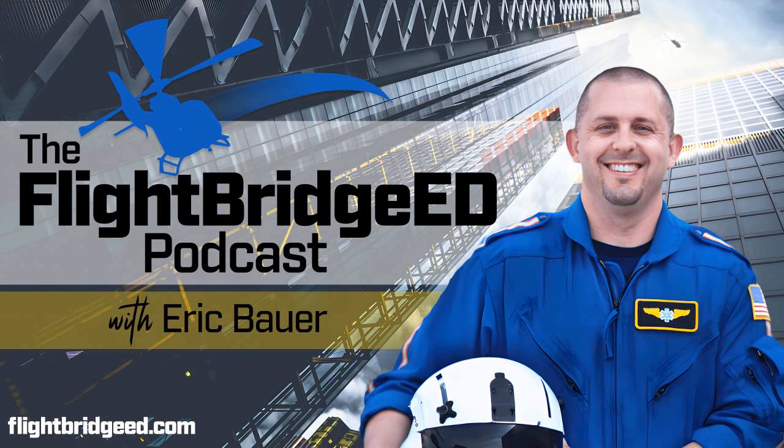What about fast flushing? So after we re-zero, you're always going to do a fast flush. And really ICU-wise, fast flushing happens usually every hour. But we have to remember that that catheter is really long. So we want to fast flush for 10, 12, 15 seconds. Think about, are you flowing enough fluid through that entire catheter? And all you're doing is making sure you don't have any clot formations. So you're going to do a really good long fast flush. Make sure your line is completely patent and clear. And again, you just need to do that every hour. So in most cases, one time in a transport, unless you're in a fixed wing environment where you're transporting longer than an hour, one time is going to be absolutely perfect.